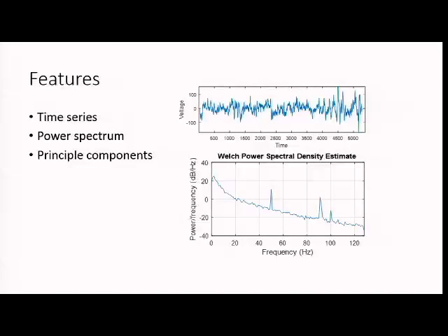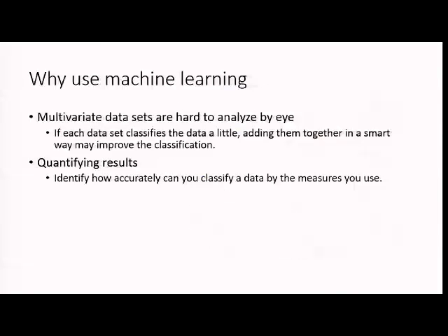When you take those measures, you have to extract some kind of features. You get raw data, and we can go from original time series, you can think of as individual time points, especially if you're looking at an evoked response. If it's time invariant, we often will look at the power spectrum of the data and look at power as a function of frequency. Sometimes we will take some kind of amalgam of all the different data that we have and try to make some kind of reduction into something that might be meaningful, like principal components. What you measure and how you extract it and distill it down is really important in the success of a machine learning algorithm.